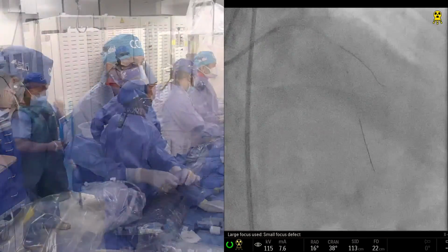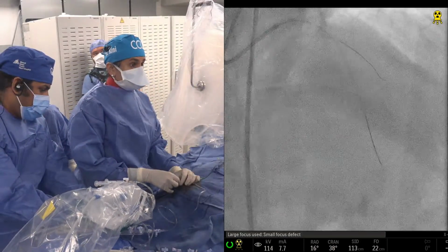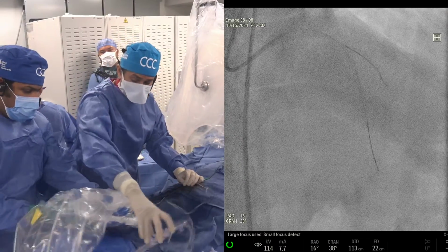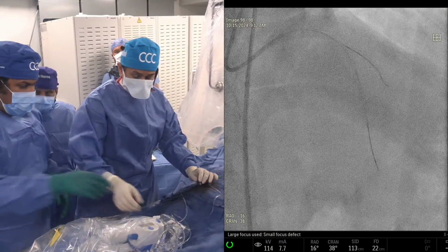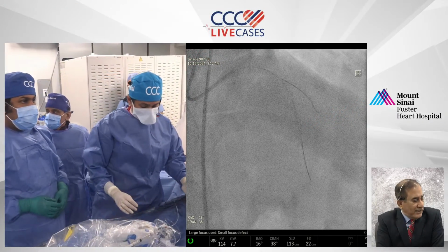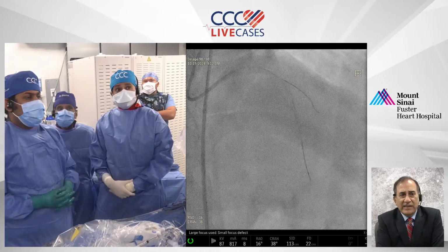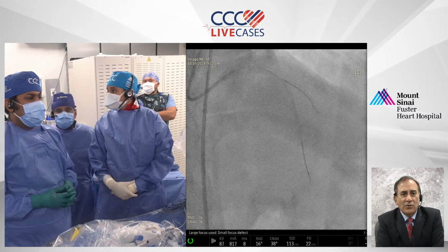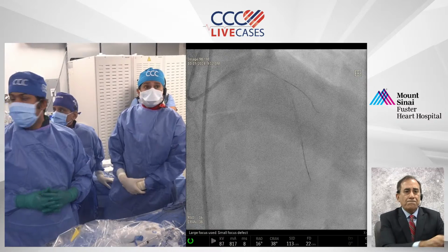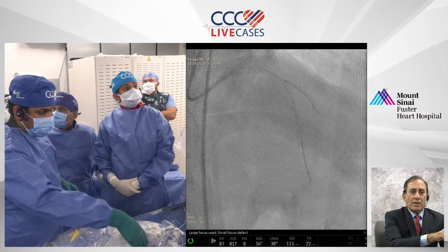And it is also my feeling, you've been very focused over almost the last 2-3 decades on gender issues. I think INOCA also plays a little more towards that too. Yeah, absolutely. Okay, let's start the IVUS. Change the screen.